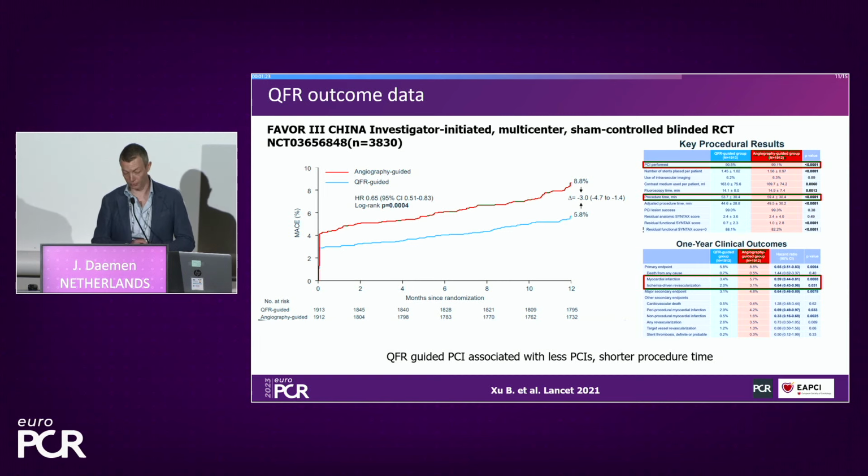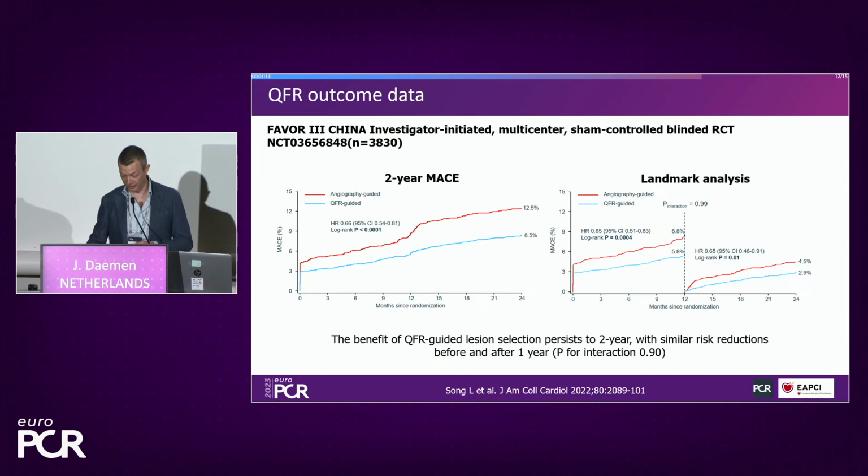And even more important, a QFR-guided PCI was associated with fewer stents and shorter procedure time. So just again attesting to the concept of physiology-guided PCI in general.